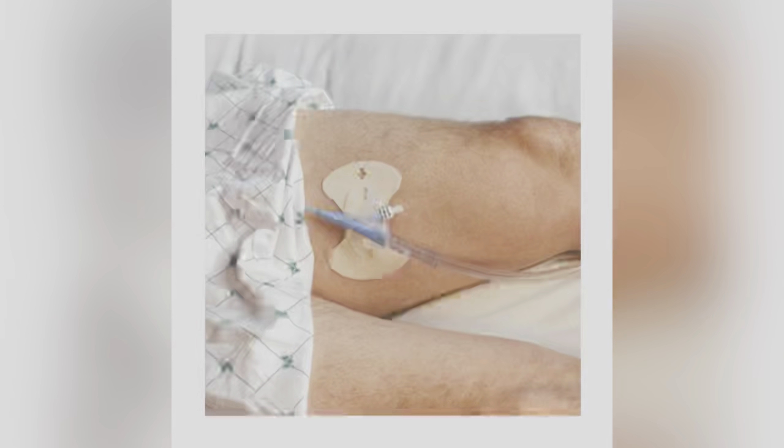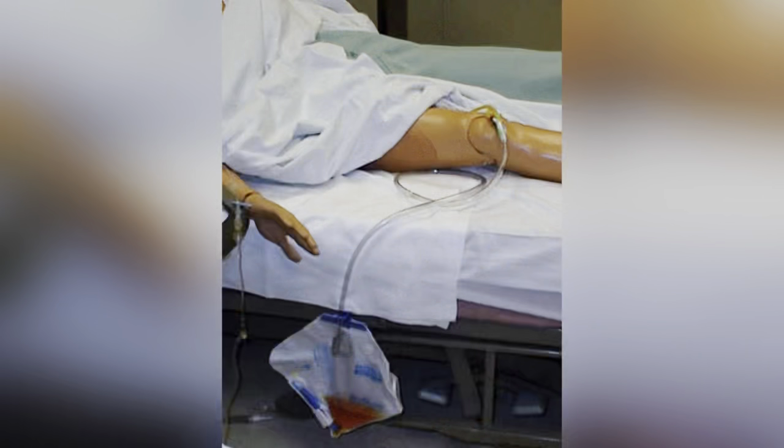After the catheter has been successfully inserted, we will then proceed with caring for the catheter itself. Secure the catheter's position close to the patient's body using a strap. This is to prevent injury caused by accidental pulling of the catheter. The tube must also be coiled to prevent kinking, which could stop the free flow of urine into the drainage bag. The drainage bag must be placed lower than the person's bladder to prevent backflow of the urine. If such a situation happens, it might lead to infection.